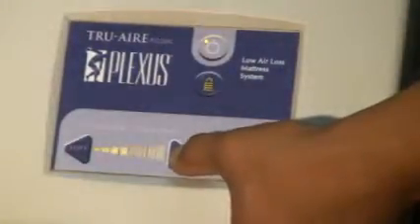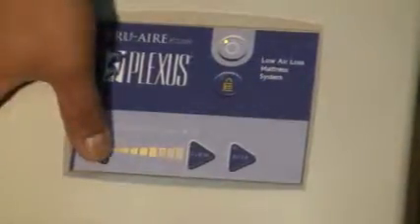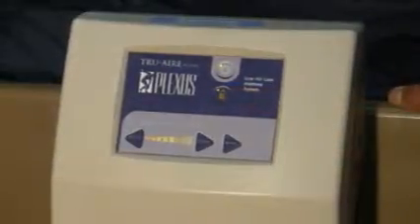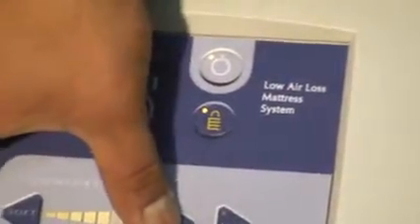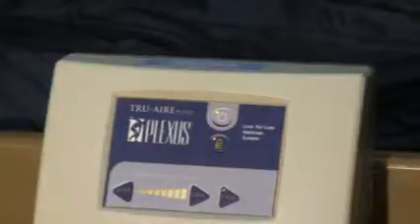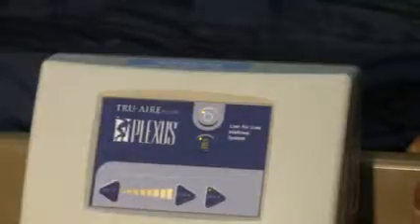Once a comfort control setting has been selected for your Plexus 2200 low air loss therapy for your patient, your lock button may be used in order to disengage the control panel from any function use. You can no longer power off or change your soft and firm control settings if the unit is bumped. The only function you would have allowed would be this max inflate button to help inflate the mattress for patient egress and ingress and for patient care.